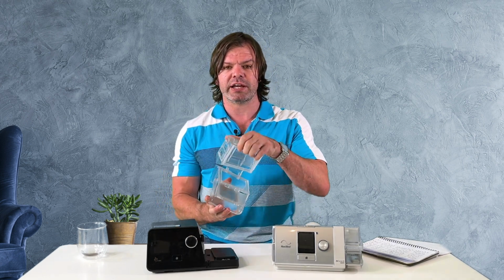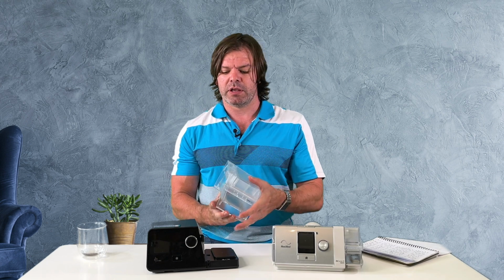Now, after portability, I'd be looking at how easy the machine is to operate. How easy is it to maintain and clean, change settings, that sort of stuff. Ease of operation is quite important, especially if you're someone maybe with arthritis in your hands. You'd be wanting to look at how easy it is to open and change the water at night time. Are the buttons nice and easy to rotate and press? Maybe if you've got eyesight or vision issues, have you got a nice big screen with nice big numbers that you can easily see so that you can change the settings? All those sort of things, the ease of operation, the ease of cleaning.